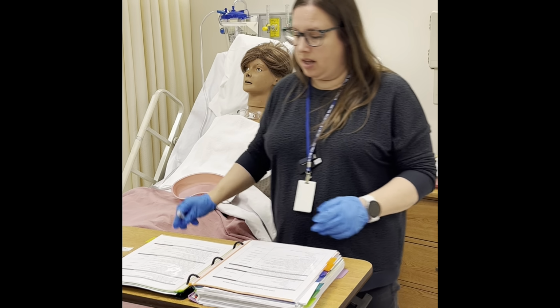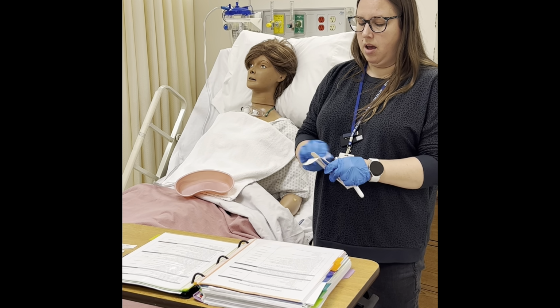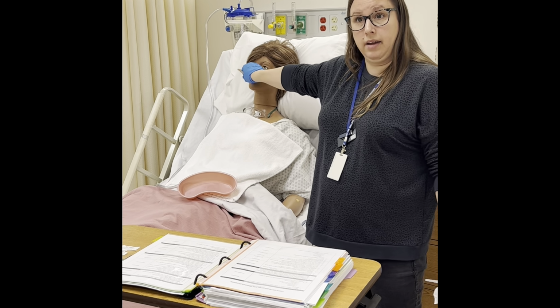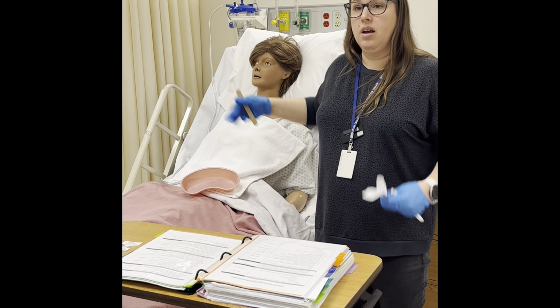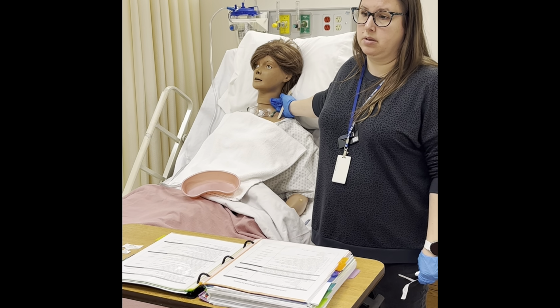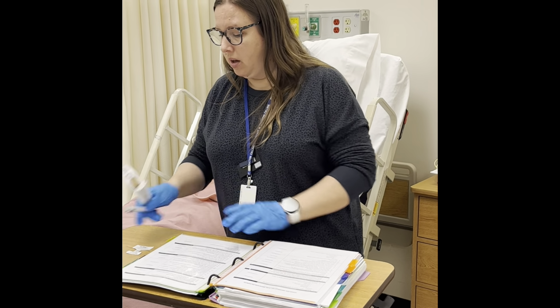So we've looked. The next one we're gonna do is test the gag reflex. So we have our tongue blade, and we're gonna go in here and we're gonna actually make them gag, because again, if they can't gag and they aspirate, then we don't want them to aspirate while we're putting in the tube. Big problems. Now we have aspirate in the lungs, our patient is probably not doing so hot.